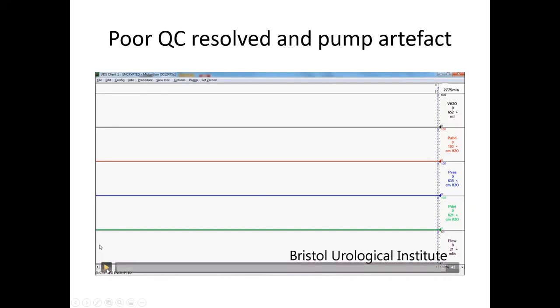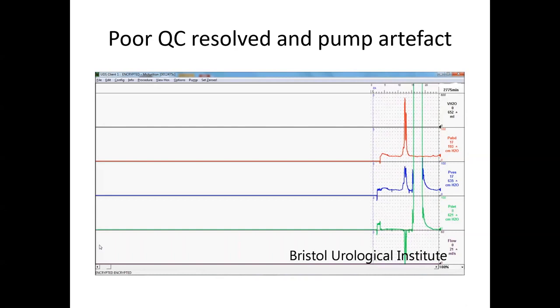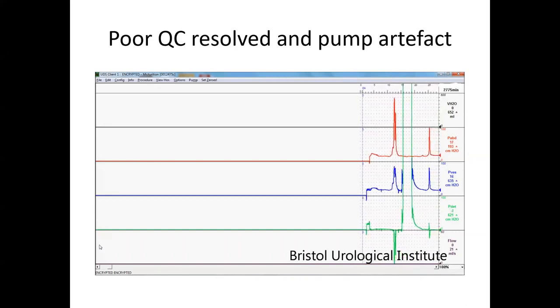So, same thing again, let's watch this one. Zero to atmosphere, you've opened it up to your patient. Hopefully we're gonna see a cough test that we weren't happy with. There you go. So our action would be that we flushed it, rapid increase in pressure, rapid decrease in pressure. In order to check that has worked, we're gonna do a cough test. There's your cough test. You're happy that you've got a nice biphasic wave.